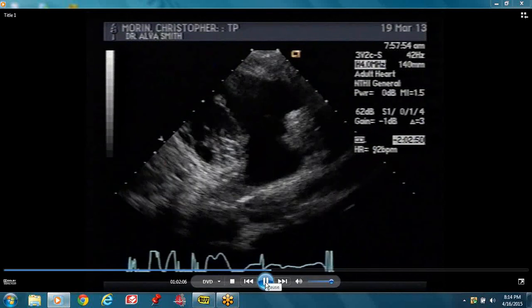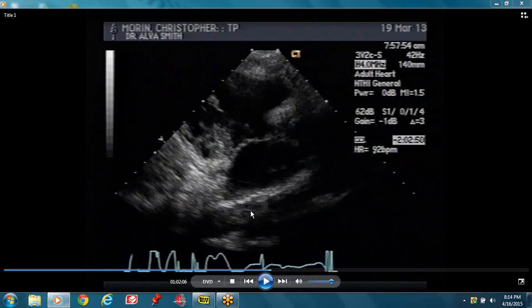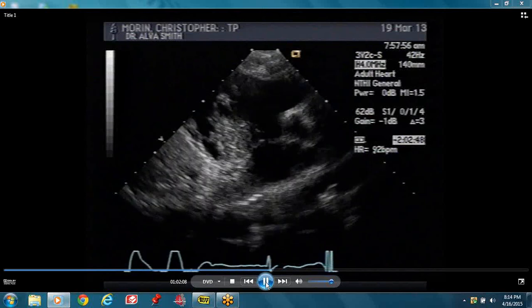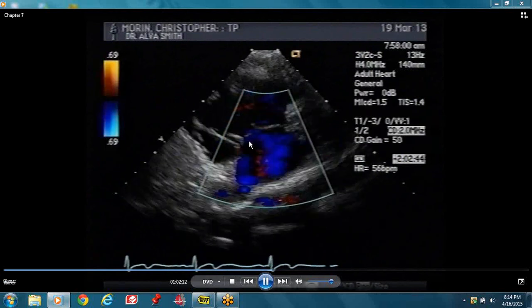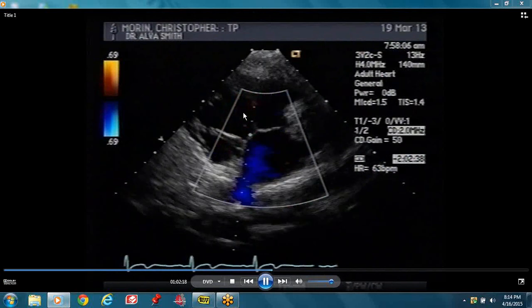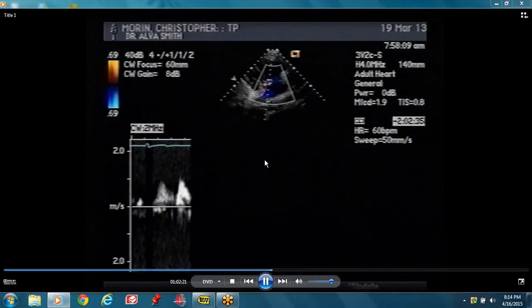This is your RV inflow view. This is the right ventricle and this is your right atrium. These are your tricuspid valve leaflets. This is the only view where you can see the posterior leaflet — this is the posterior tricuspid leaflet and this is the anterior. You can see color going backwards from the RV to the RA, which is tricuspid regurgitation.